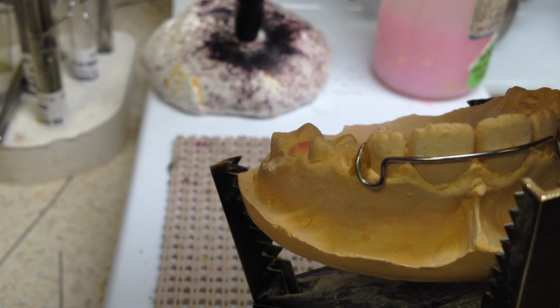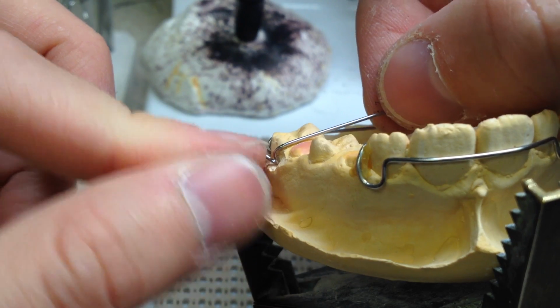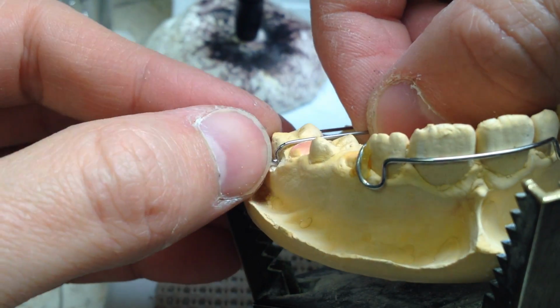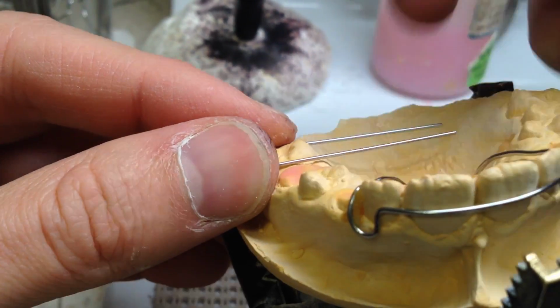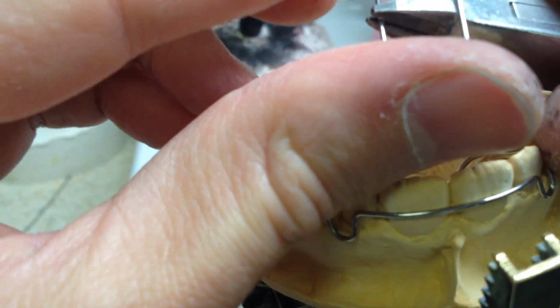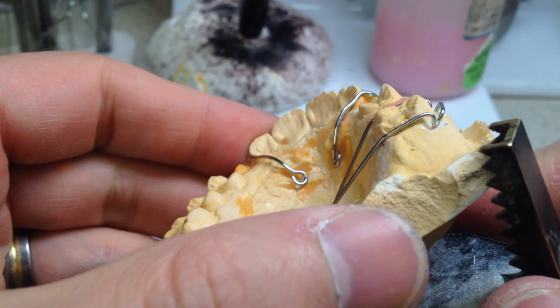So if I want to decrease it, I change that bend. And you see how the angle's closer to the tooth. Alright. Just always keep an eye on your bridge, your angle there over your tooth, as you continue to adapt the wire and the palate. Okay, then you finish as you normally would.